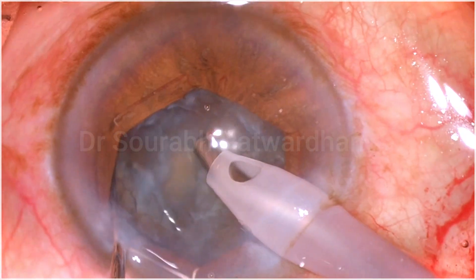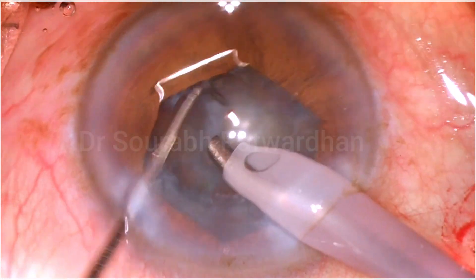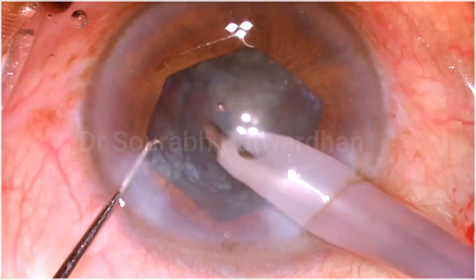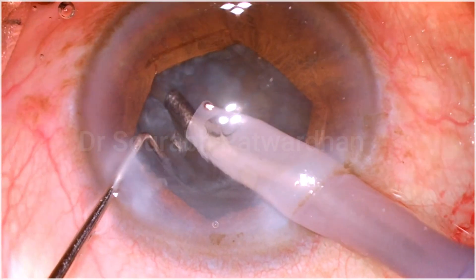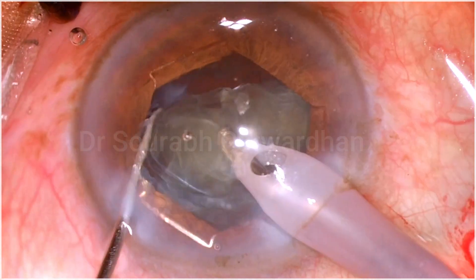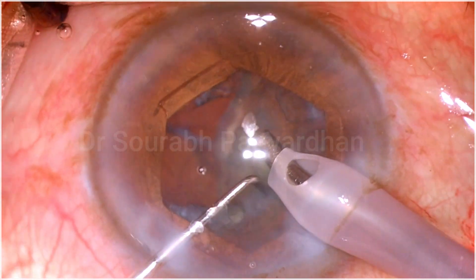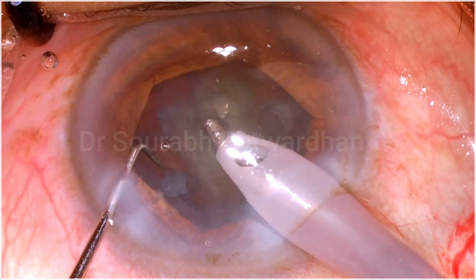For any such case, it's very important to have a deep trench, and you can see that I could now separate the pieces. You have to try to take out the first piece which is free from both sides — that's what I am doing now. I am making sure that the piece I want to remove from the bag is free from both sides. Once you have that, you can use high flow rate and vacuum to pull out the free piece from the bag. This piece was free and I could easily pull it out. Once one piece is out in this soft cataract, you can take out all other pieces reasonably easily.